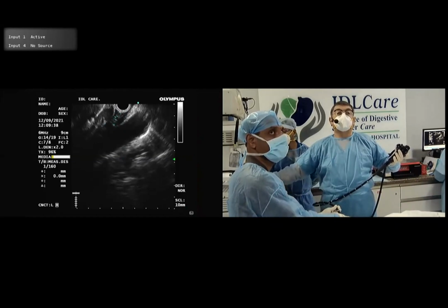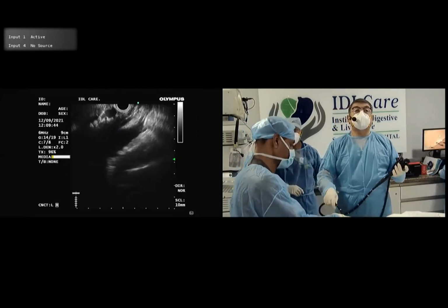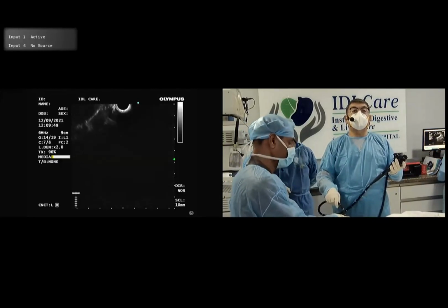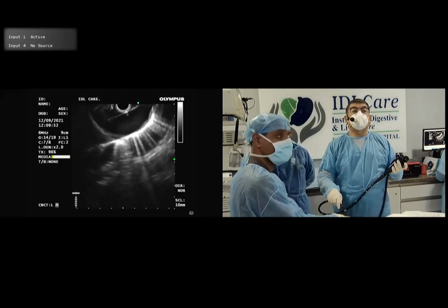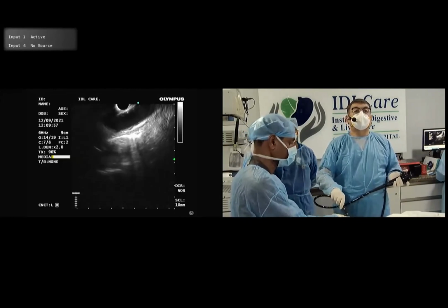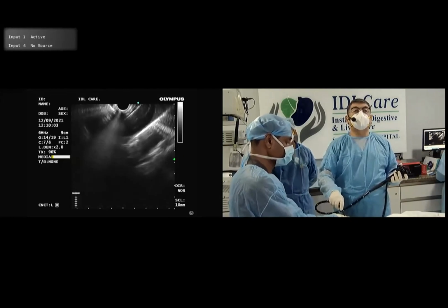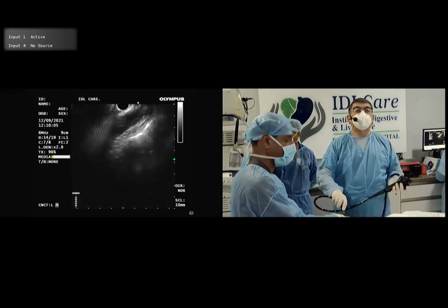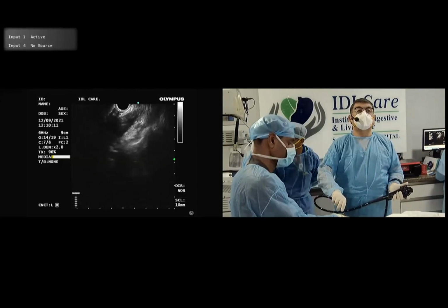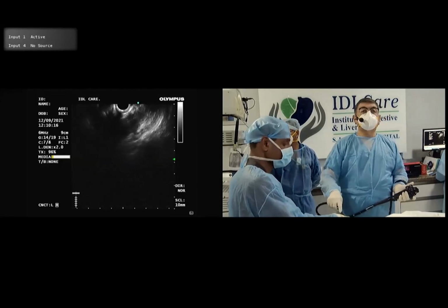See this? So I quickly go like this, a little anti-clockwise. I am at the neck now. A little anti-clockwise, a little up, continuous sucking, and I create a tubular vision of the esophagus. Like this, you see there is a lot of air in the esophagus. Sometimes you may need to use the up-down control, keep it down, and keep a tube of the esophagus. See this? This is the tubular view of the esophagus. We are going down. I find this method extremely useful for a quick evaluation.